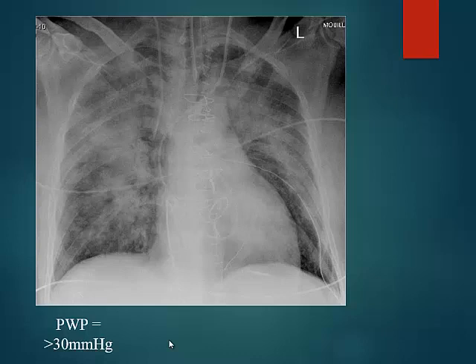Two common causes would be pulmonary edema, if it is bilateral and symmetrical, or infection. The word consolidation we don't use anymore; we use airspace shadowing. If it's bilateral like this, generalized and particularly perihilar, then we say it could be pulmonary edema, in the right context obviously.